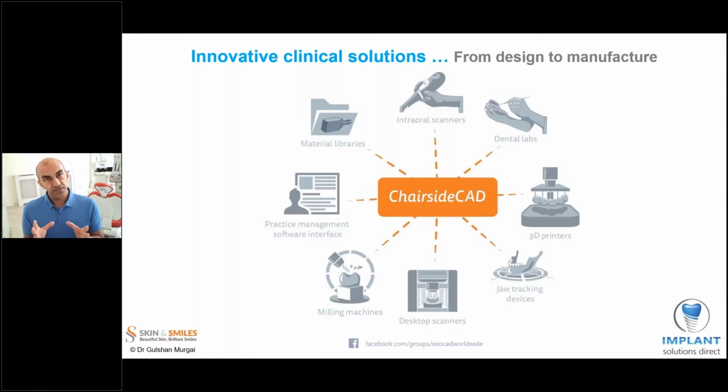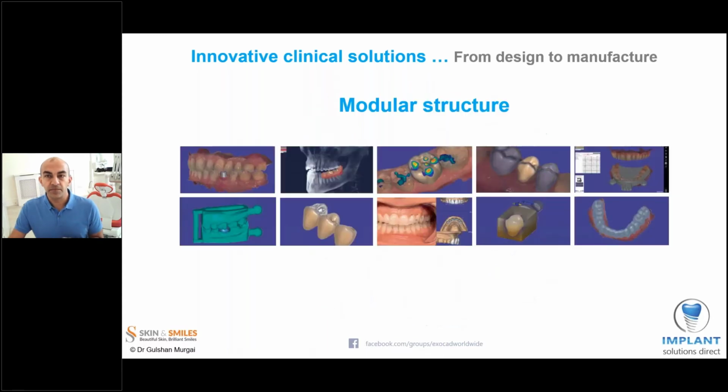So one of the benefits of ChairsideCAD as a software package is in its fabrication, in its construction. exocad spoke with material producers, intraoral scanner producers, dental labs, 3D printer manufacturers, and desktop scanner manufacturers, because exocad is famous for creating open platform software. And so that they created an open platform that is accessible to the many and not the few, they have really collaborated well with all of these different people.